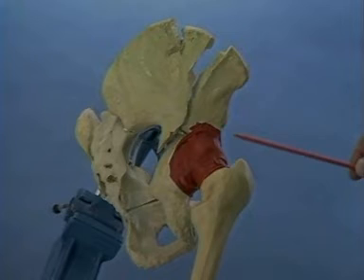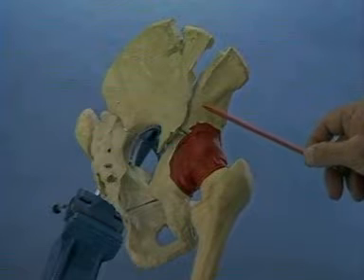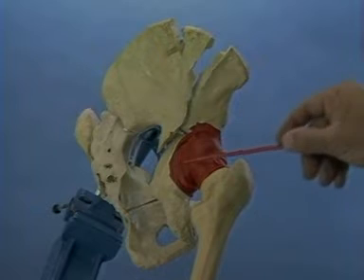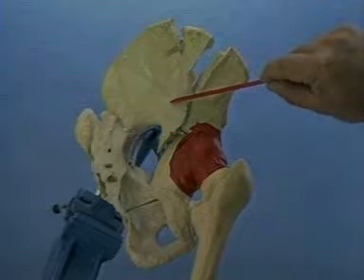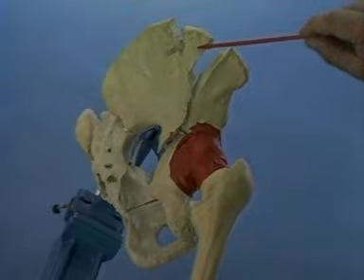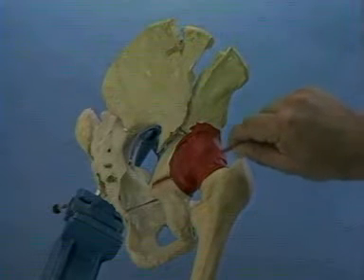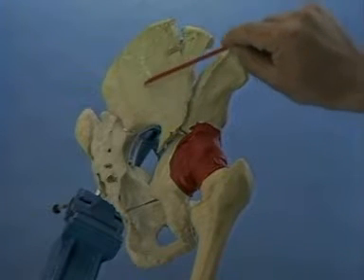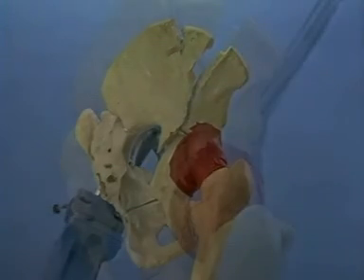Shown is a both-column fracture of the acetabulum. The anterior and the posterior column are completely separated from the intact portion of the ilium. No portion of the articular cartilage remains attached to the intact portion of the ilium. There is a triangular segment of the ilium found at the iliac crest. Open reduction and internal fixation of this fracture can be performed through the ilioinguinal approach because the posterior column fracture is simple — that is, the posterior column remains in one piece. Additionally, there are no displaced fracture lines through the ilium that cross the sacroiliac joint.